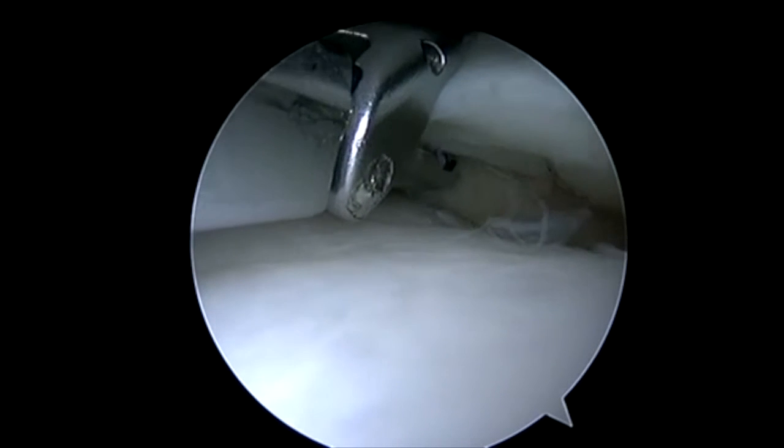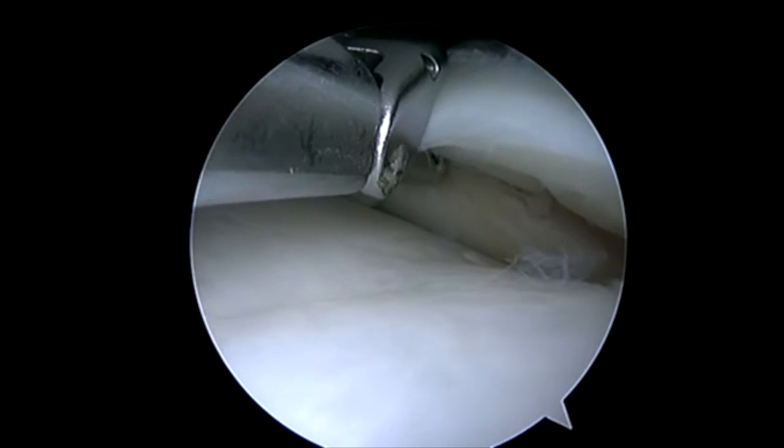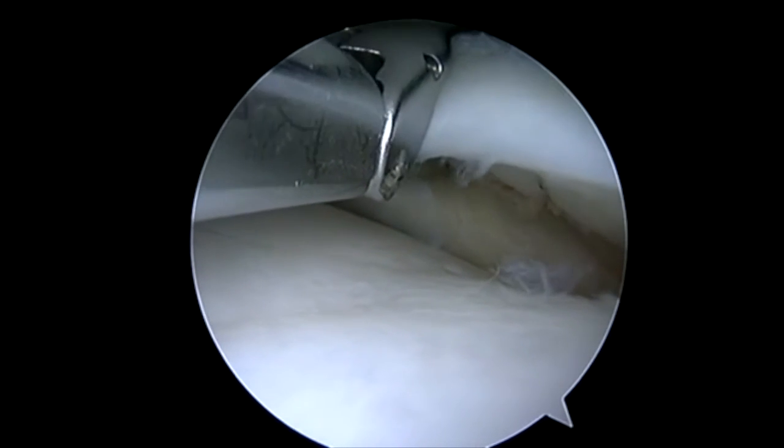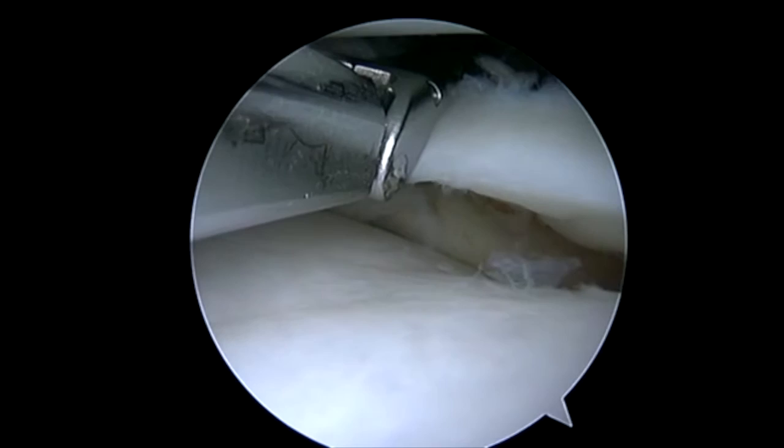So here you can see to the right I've already passed a couple of stitches. I'm going to pass another one — peripheral after I've passed central. And what you can see is I'm lifting up to make sure I don't get into the popliteal tendon that's just behind us, below the bottom jaw of the device.